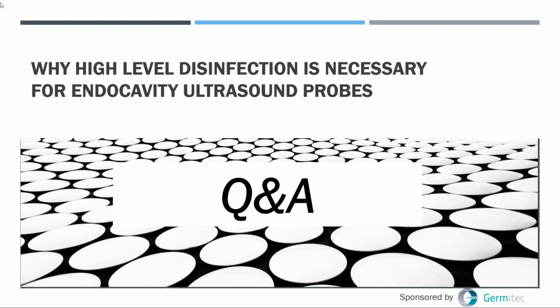So if you're using the probe on intact skin, such as for, as you said, a biopsy of a thyroid nodule, or an amniocentesis, or for putting in an intravascular line, we widely use these for putting in subclavian lines. The answer in the United States, again, cleaning and low-level disinfection are considered adequate. If you choose, you can certainly do high-level disinfection.